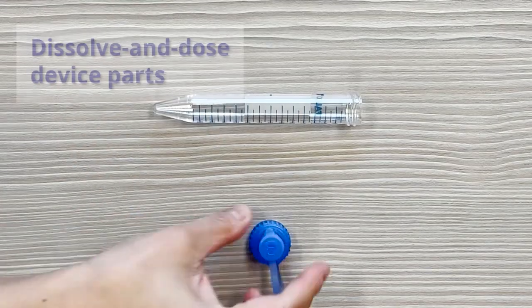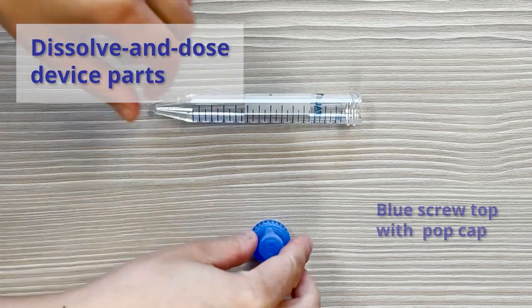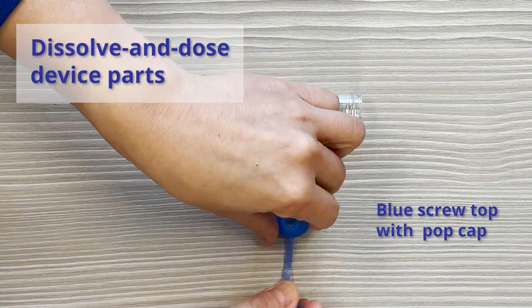The dissolve and dose device has two parts: a blue screw top with a removable pop top cap, and a tube for the liquid.